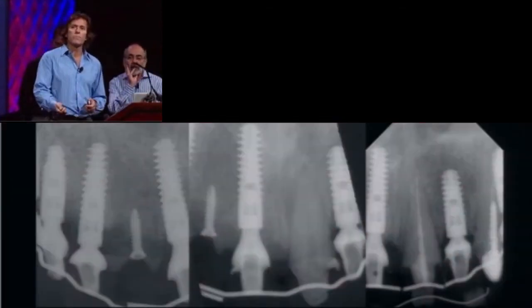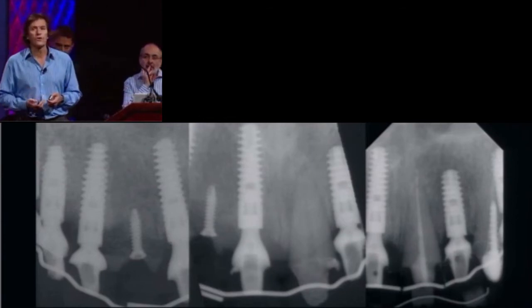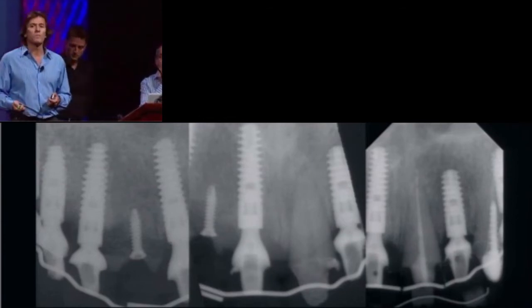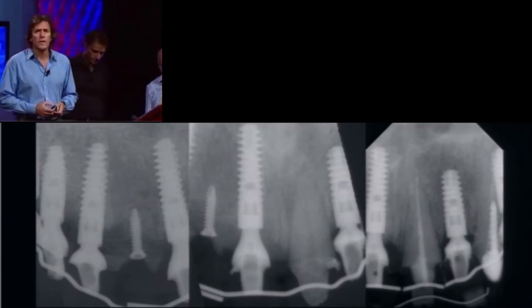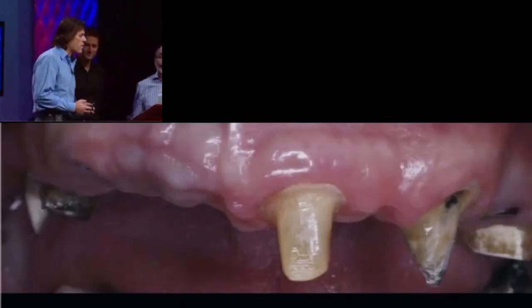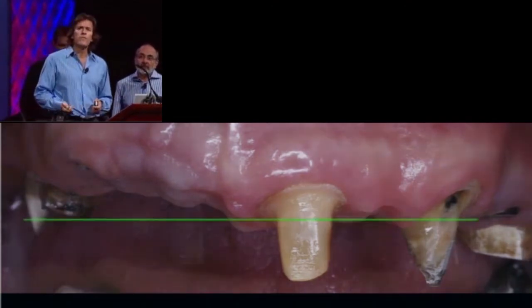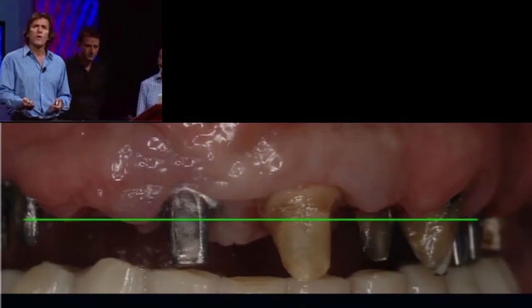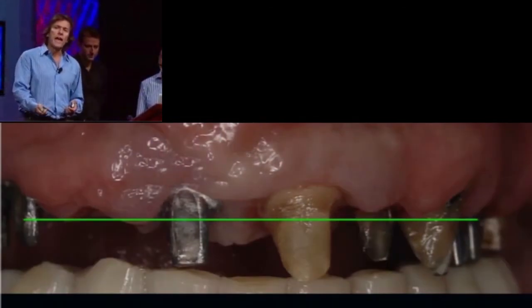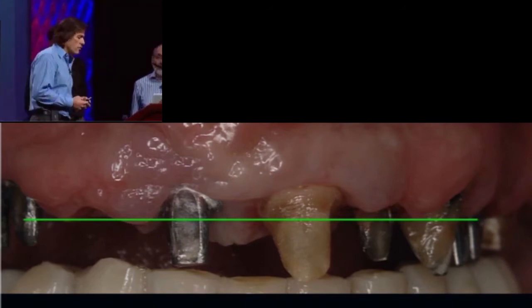And we placed our implants, and here you can see that bone graft secured in the vertical and horizontal position, shaped to reconstruct the interdental heights. And we were able to take this patient. We waited approximately 8 months during the temporary phase. And what we've been very, very happy to see on the cases where we can keep the block submerged, we're able to actually engage and enhance that pontic site, both in the buccal and vertical component.